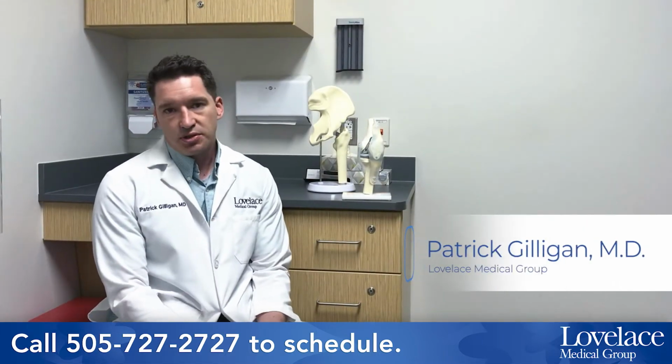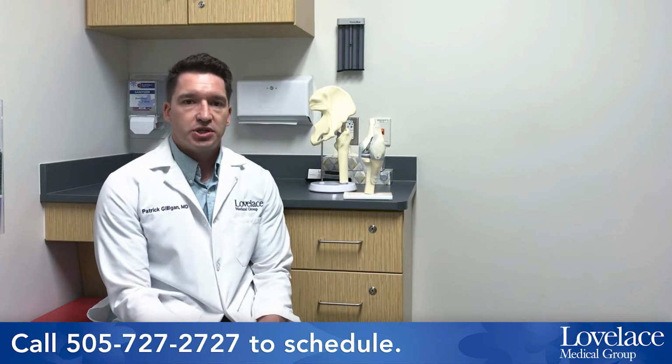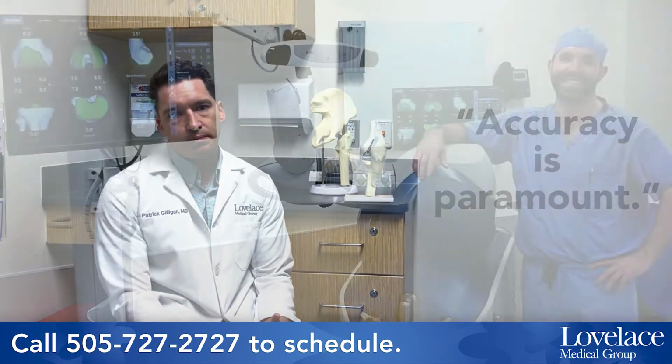A lot of patients ask me if the robot is doing the surgery for me, and that's not the case. What I prep my patients for when I discuss with them is there's a couple things that the robot technology does not do. It does not do the surgery for me. I'm there, I'm scrubbed in, I'm the one making the adjustments and doing the surgery. It does add an extra incision, which patients should be aware about, and it doesn't necessarily speed up the procedure itself, but I do think that it makes it more accurate. In the end goal of these long-term surgeries, that accuracy is paramount.